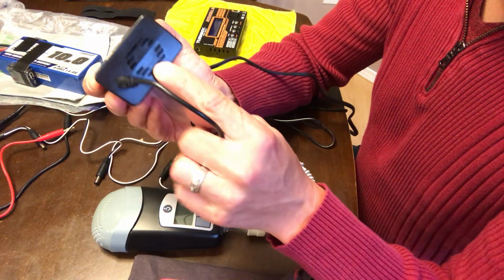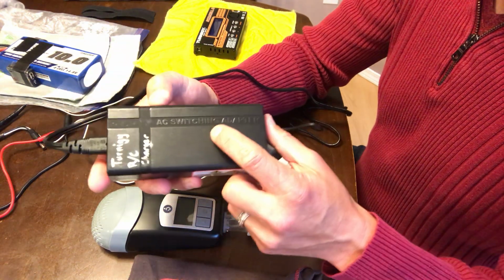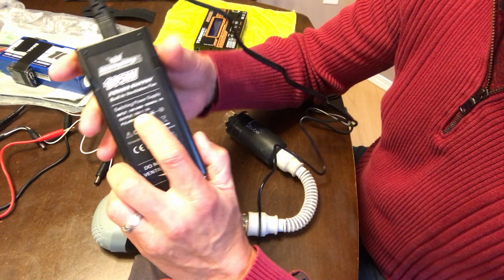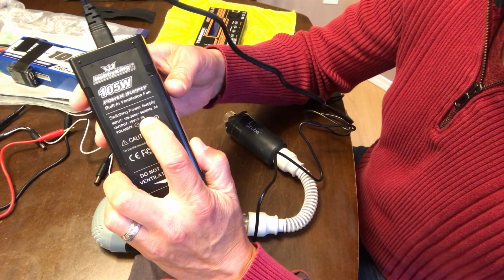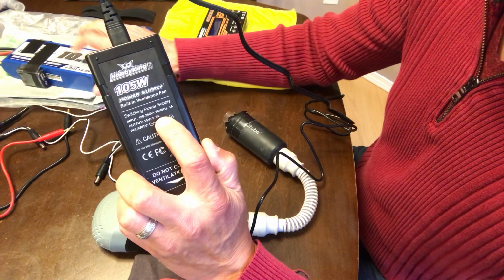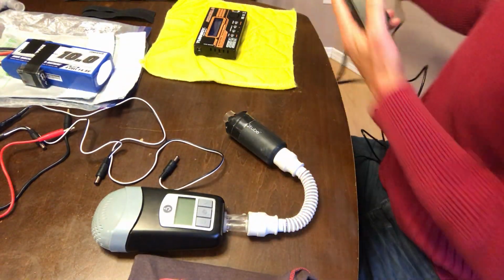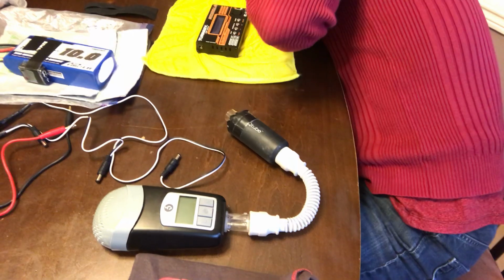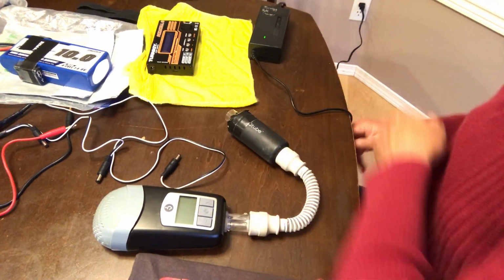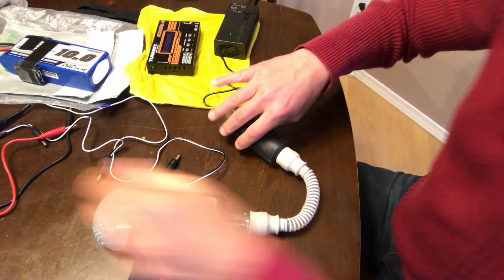It has an internal fan, and this is just an RC charger. It was made in China, nothing special, but it has an output of 15 volts, which is the same as the other one, but it's 7 amp. And that extra amperage gives me some extra juice to charge a battery when I need to. So this was the power supply I went with. And we're going to plug that in real quick. Let that get started.